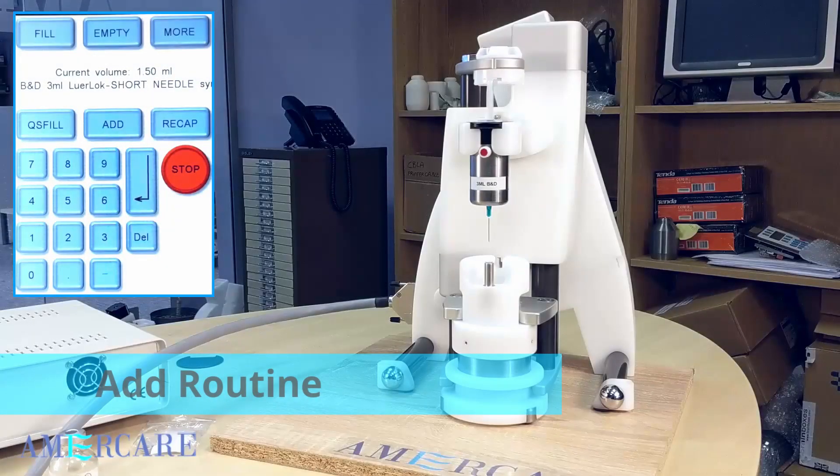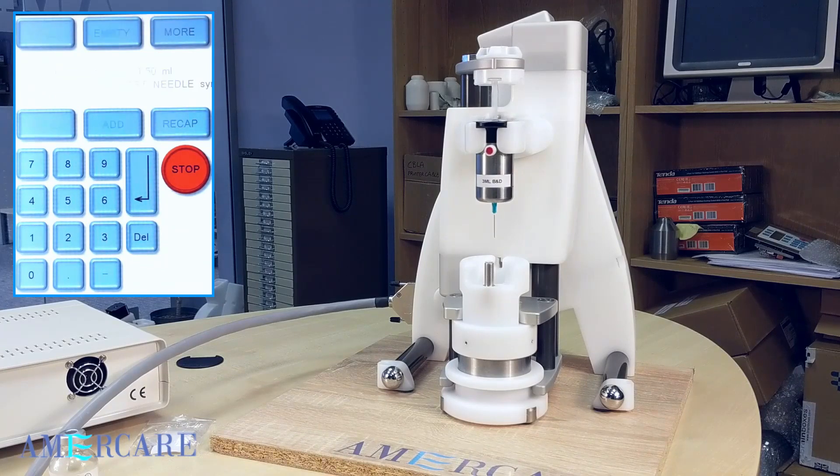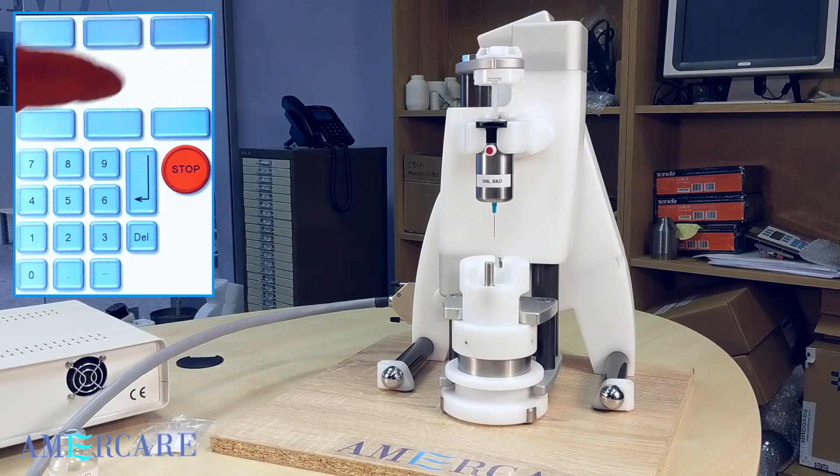The add routine gives you the ability to add product from a previously filled syringe. Press add. The syringe will now move in and the system will ask if the syringe has loaded ok. If it has loaded correctly, then press yes.